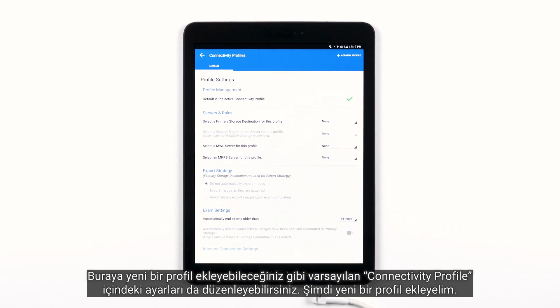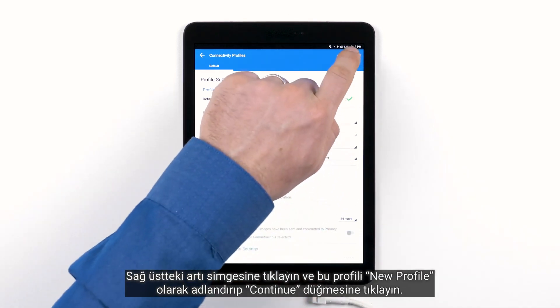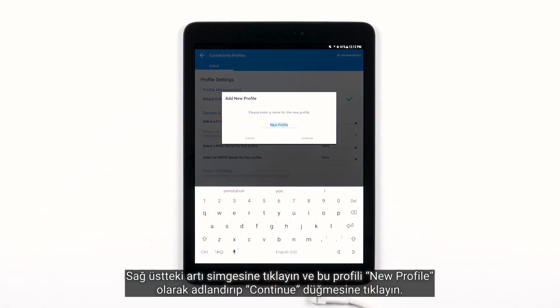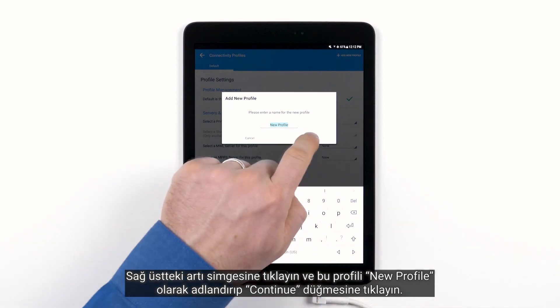Let's add a new profile. Tap the plus icon in the top right, and we'll just name it New Profile. Tap Continue.